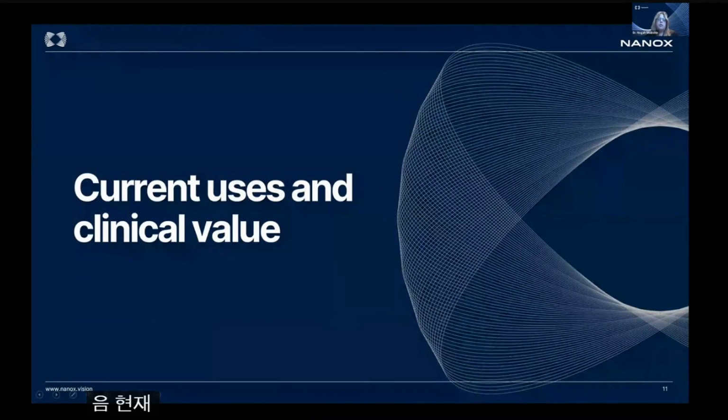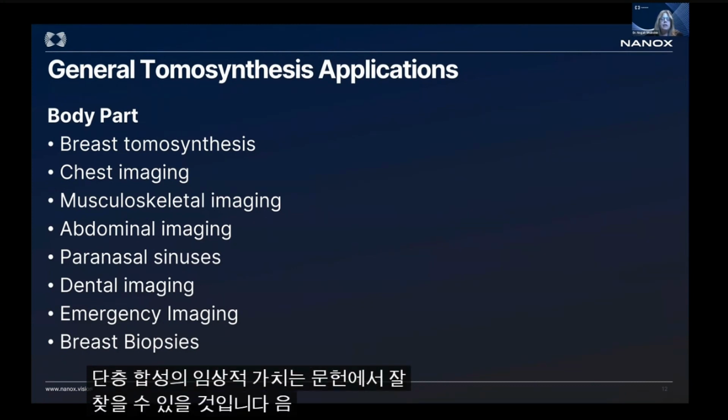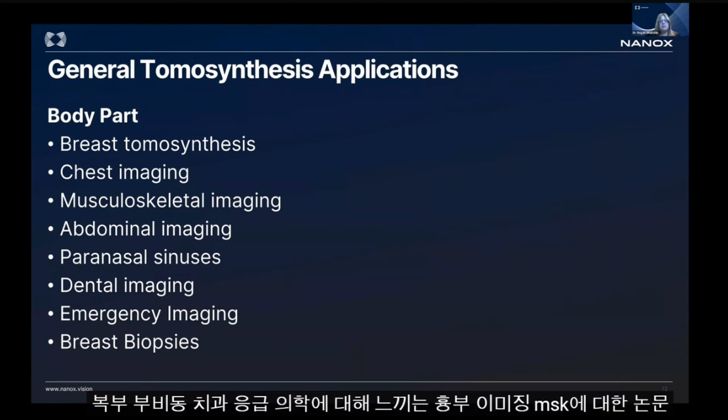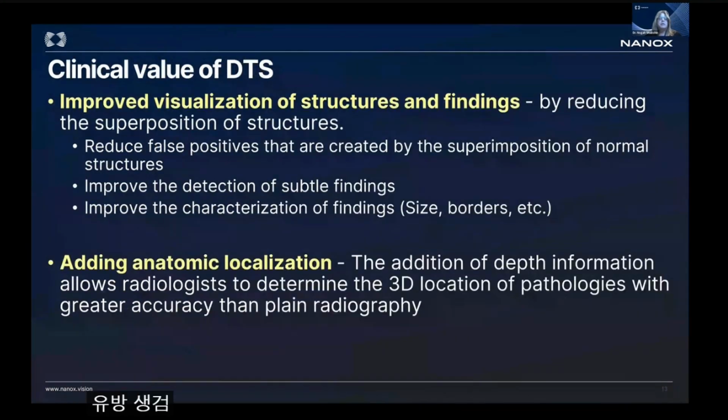What are the current uses and the clinical value of tomosynthesis? Well, in the literature, you will find papers about chest imaging, MSK, a few about abdominal, sinuses, dental, emergency medicine, and even papers about guidance for breast biopsies.